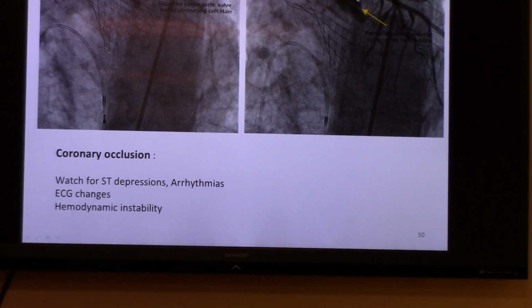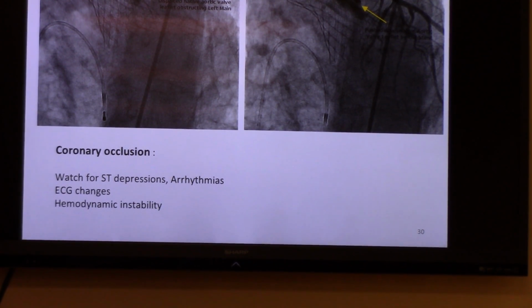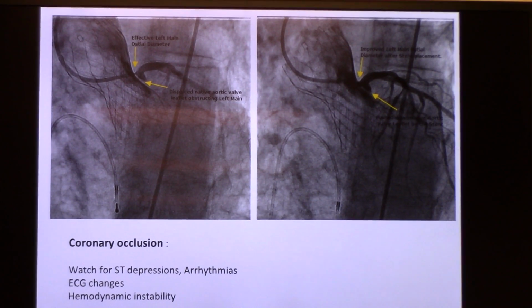And then what we do is put a stent, bring it over inside into the stent, the valve strut that keeps the ostium open. Do you see that at the time of putting the valve in, or does this happen a day later, with chest pain? That usually happens during the valve deployment. You can also see it post-procedure too.